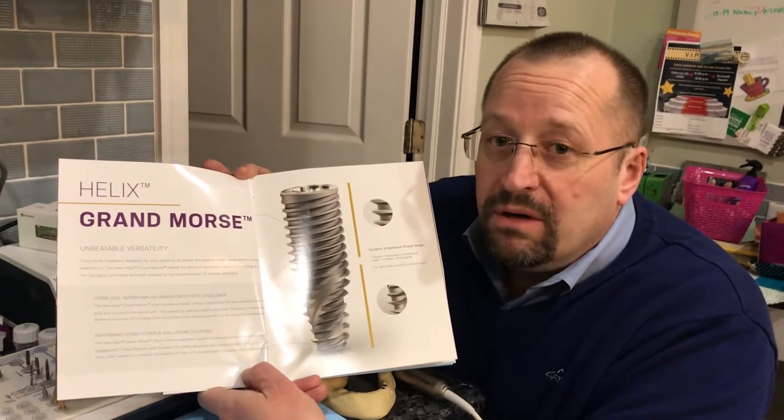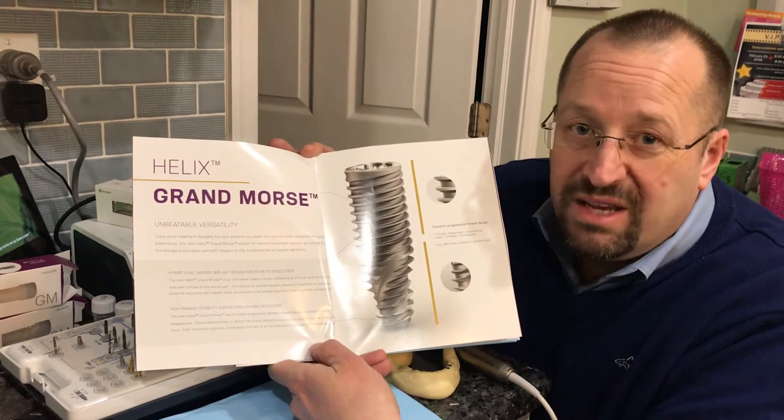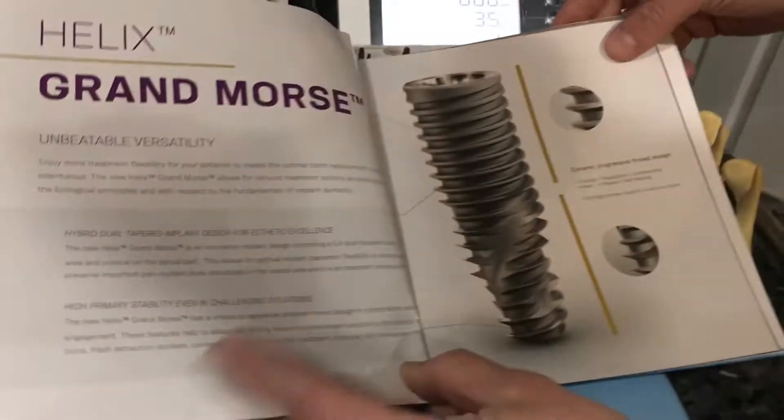Hi folks, today we're going to go over Neodent's Helix implant, the Grand Morse Connection or System. This implant is where science and innovation meet.